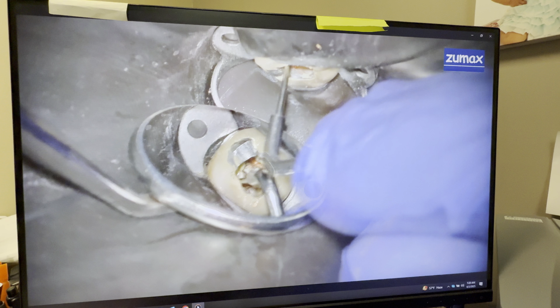I'm sorry, I thought that was a number 20 flare file. It was not. It is a number 15 C file. I thought I saw yellow, but it was not. I thought I was seeing the yellow of the flare file, number 20. No, it is a number 15 C file. I apologize.